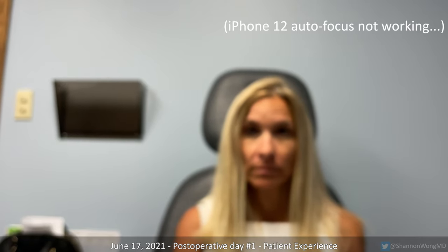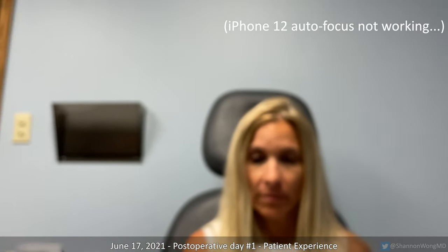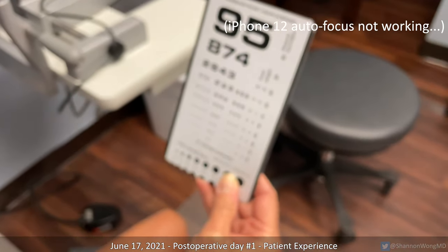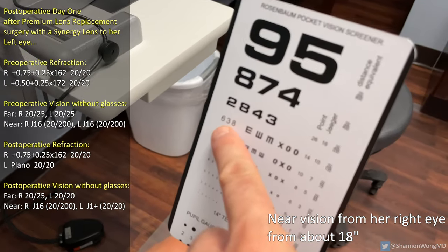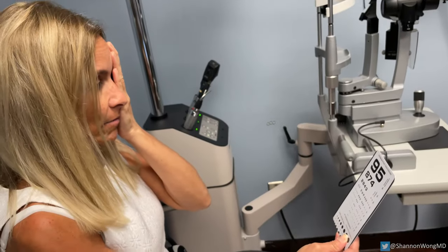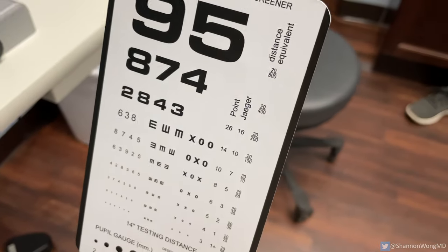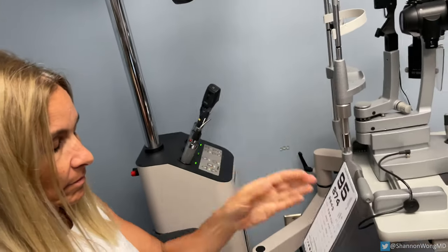Her right eye has not yet had surgery. We have her cover her left eye and hold a reading card at about 18 inches away. With her untreated right eye she can barely make out a line — she thinks it's '2843' but it's foggy and her eye is trying to focus but not getting there. That corresponds to the 20/200 line. She is unable to read the card clearly without her glasses.